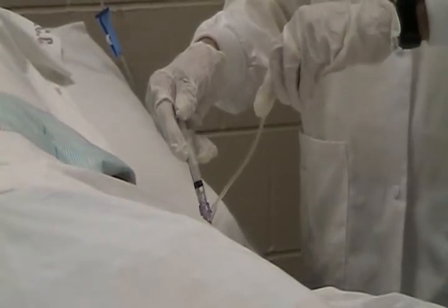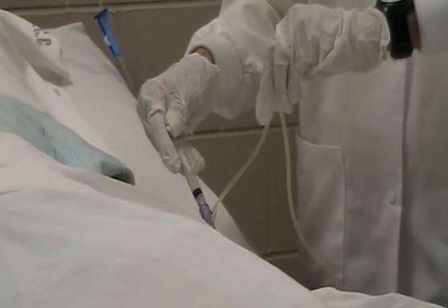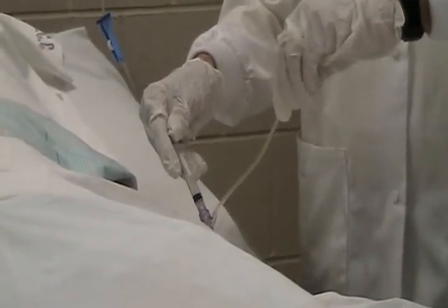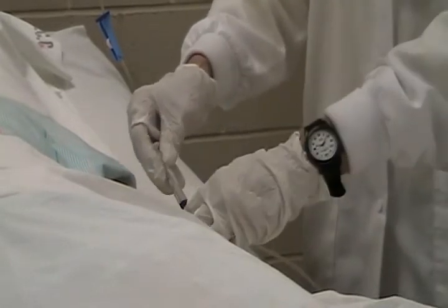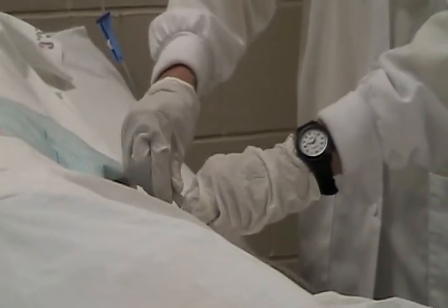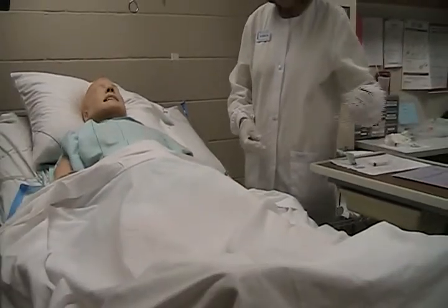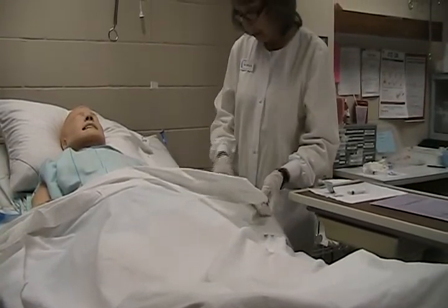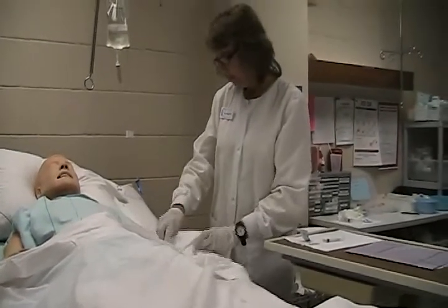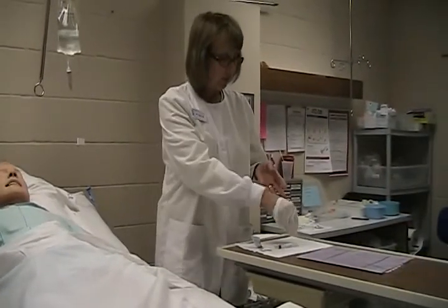And now for my last 15-second increment, I'm going to administer the last 0.3 of the medication. Release the tubing and remove my syringe. I reassess the IV site, checking for patency. Remove my gloves.